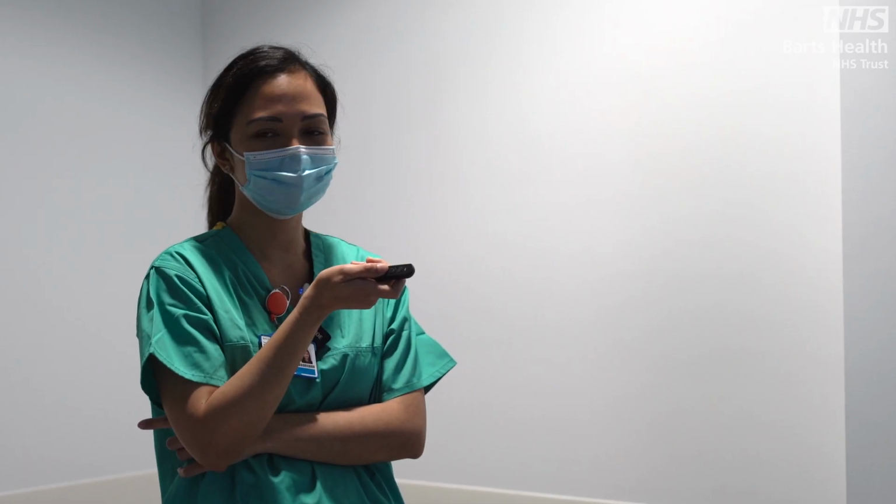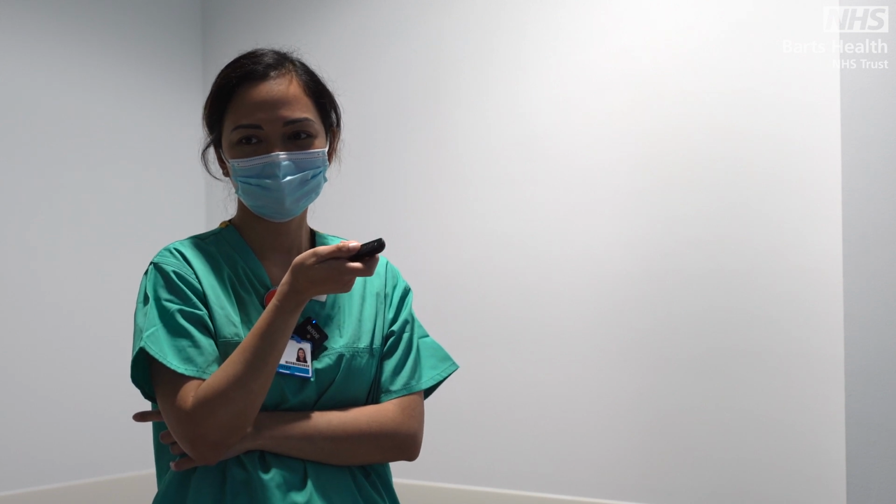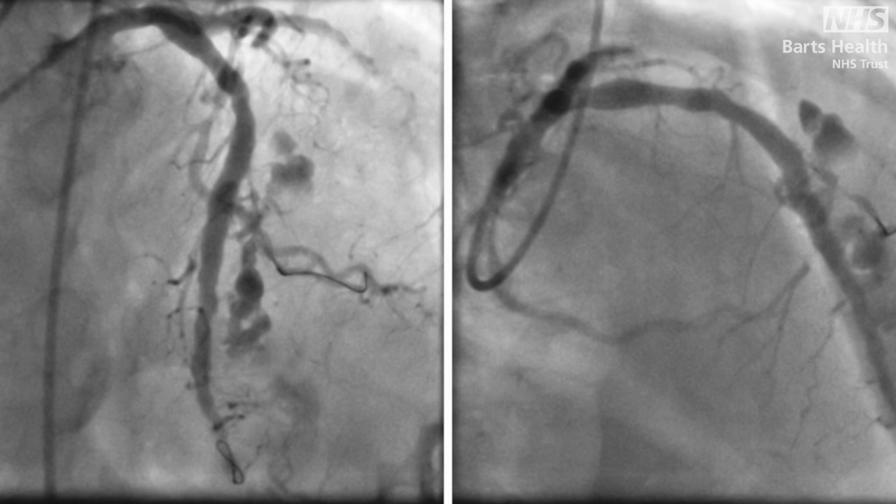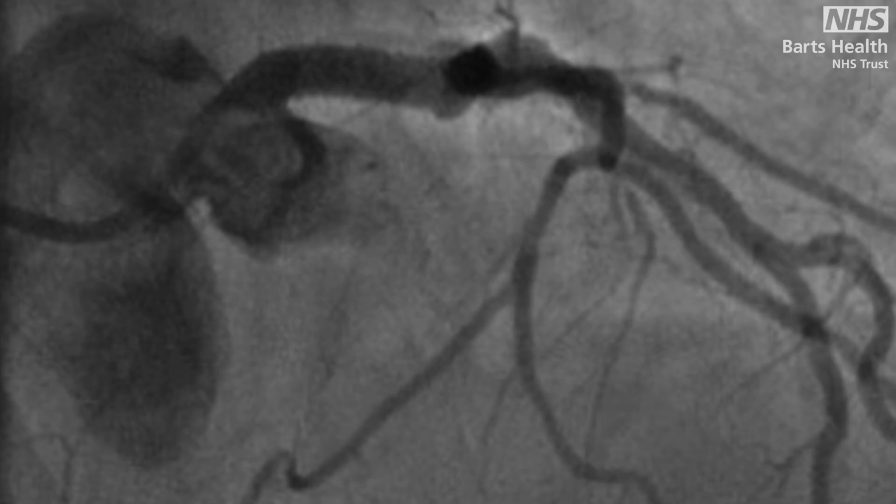So who has seen a perforation in real life, like in the labs? Can you share? What treatment did you do? So with perforation, the key really is to have a wire. Because if that happened without a wire, just block, the patient will die.